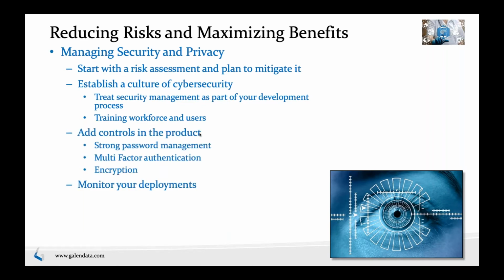Add controls in the product, so make sure you have strong password management, for example. Things like the complexity of the password, how often it needs to be changed, how frequently you can reuse passwords. Now there are some usability challenges around that. The more complex you make passwords, the harder it becomes for the user to remember. More likely they will write it down and share it, or use the same very simple password across systems. So you have to put a balance around that.